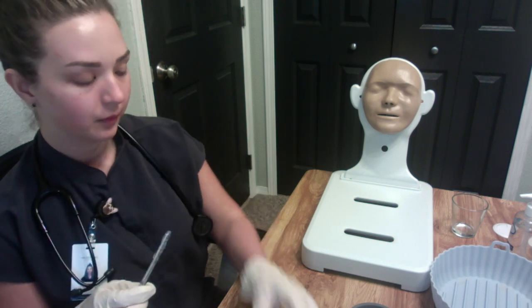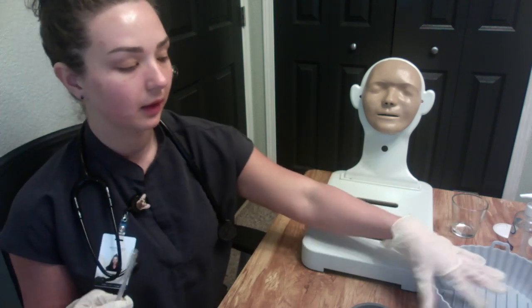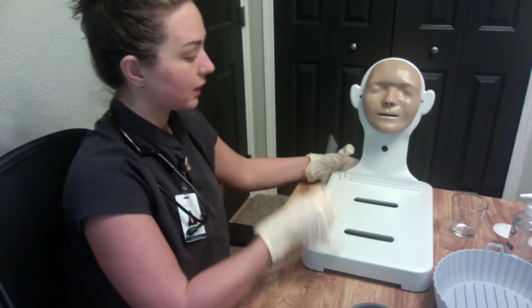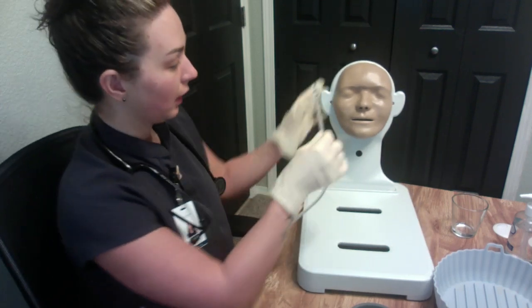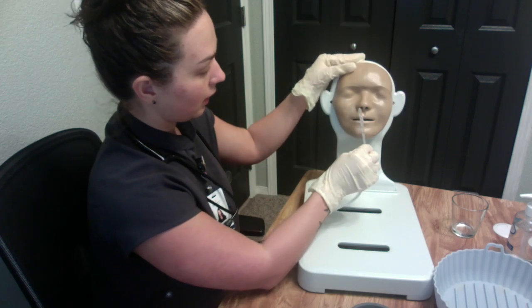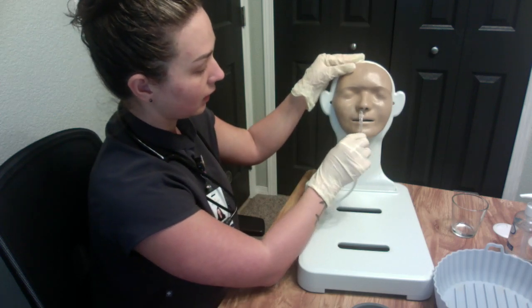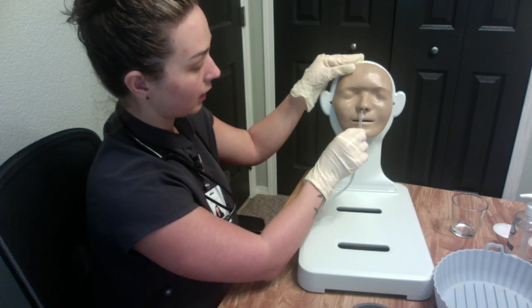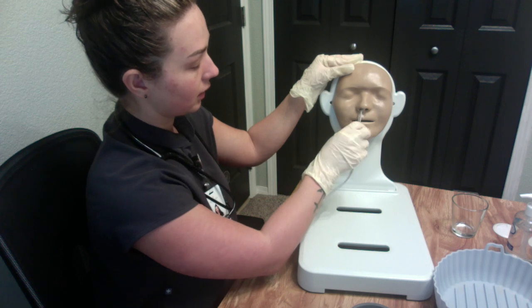Okay. And while we're prepping the patient, we would be setting this in the warm basin as well. All right, Mrs. Smith, are you ready? Okay, so we're going to go ahead and insert. We're going to go along the nasal cavity. Okay, insert.